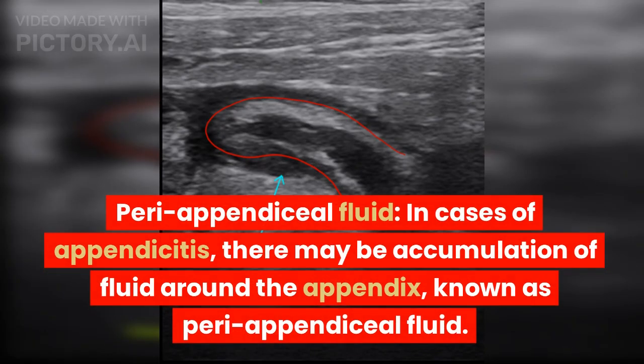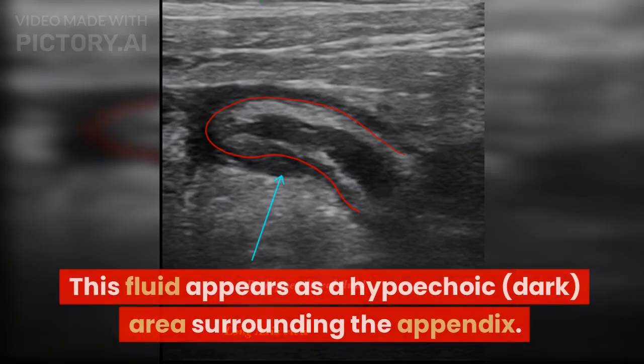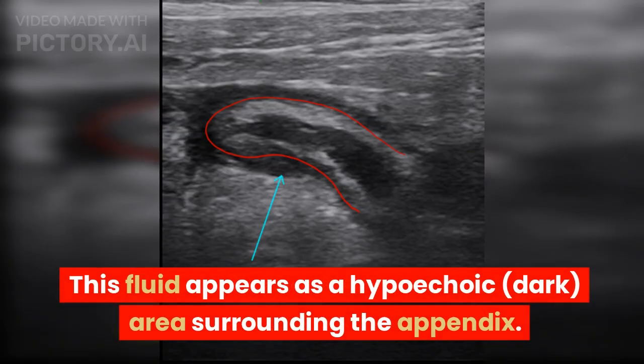Periappendiceal fluid. In cases of appendicitis, there may be accumulation of fluid around the appendix, known as periappendiceal fluid. This fluid appears as a hypoechoic, dark area surrounding the appendix.